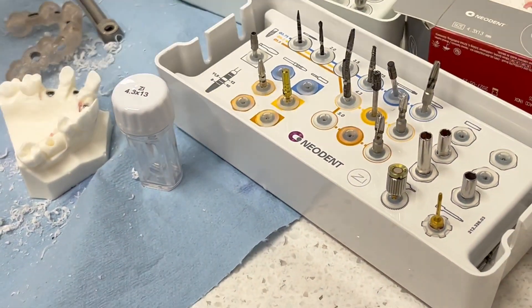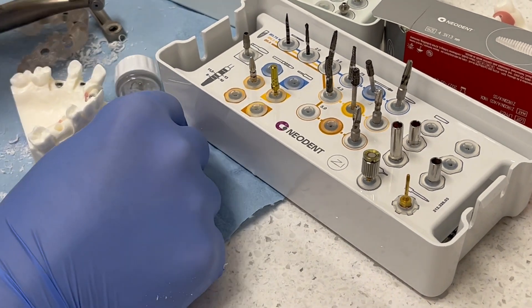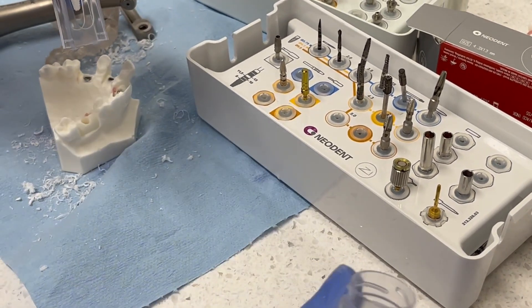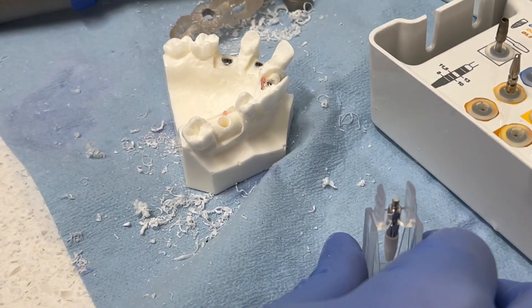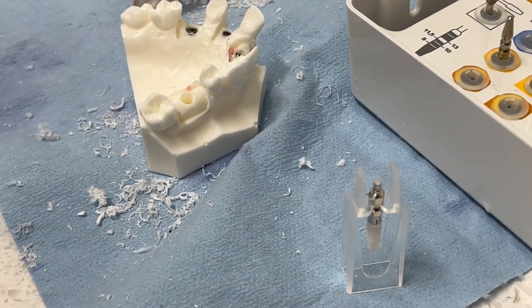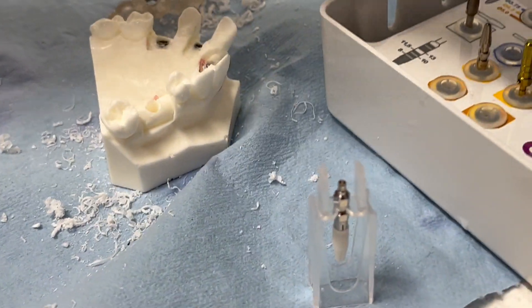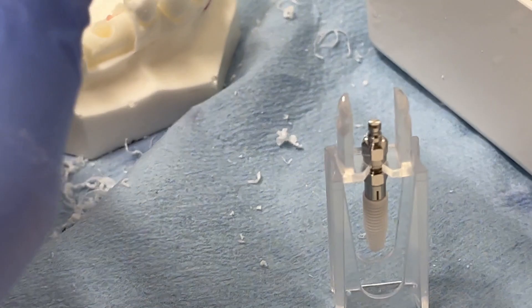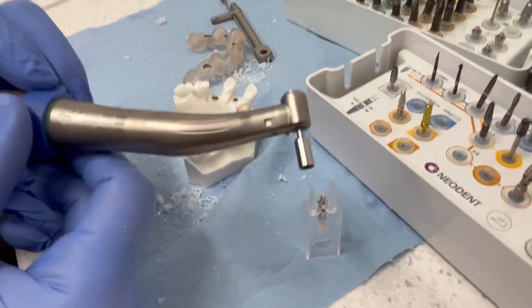We're ready to place. So the difference between GM and ZI, we're going to be driving this implant down with a mount instead of at fixture level. This is just a protective feature so we don't over-torque and put too much torsional strain on the implant, which could cause fracture. So we can see now we have our ZI mount driver on our handpiece.